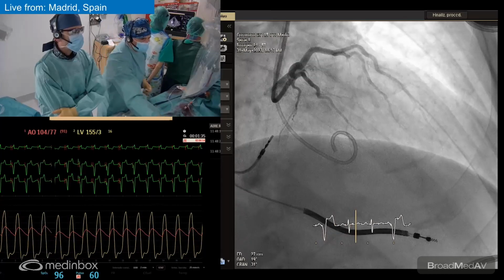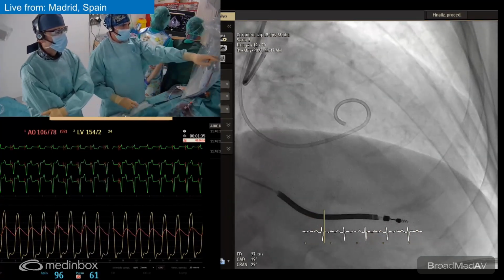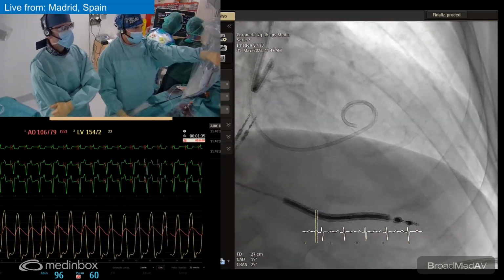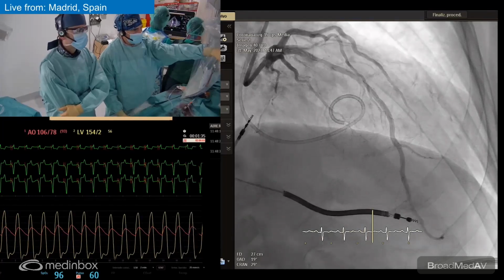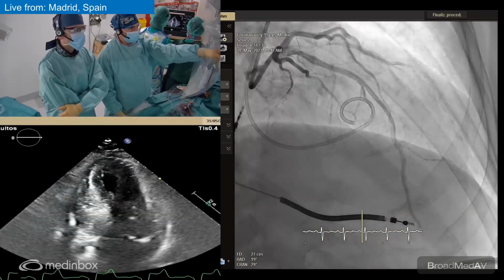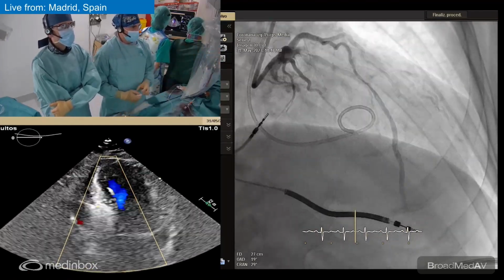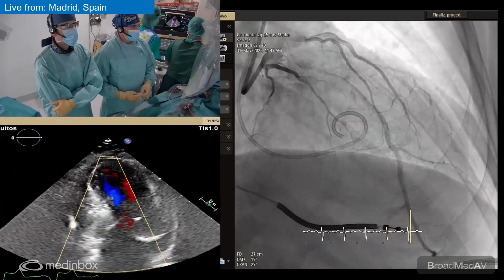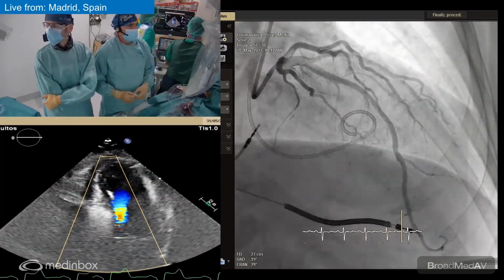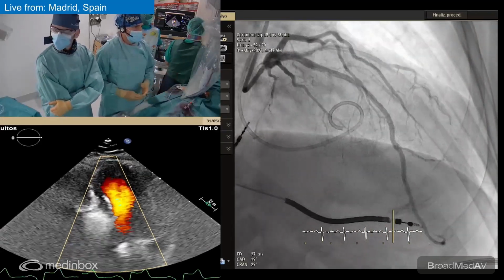In patients with only 1 big septal, the effect is like Santi told us. Yeah, you can see in the second of the big septal branches, that is a trifurcated branch, the bigger of the branches has a clear phenomenon of milking or systolic compression due to being inside the hypertrophic myocardium. So probably this septal will be more accurate than the previous one, maybe.